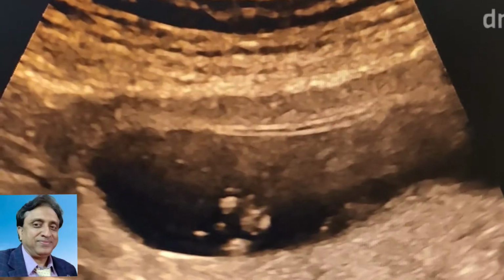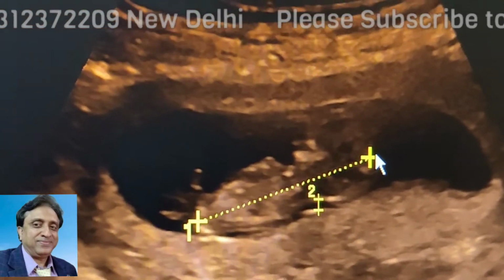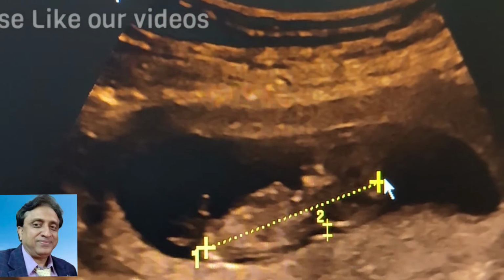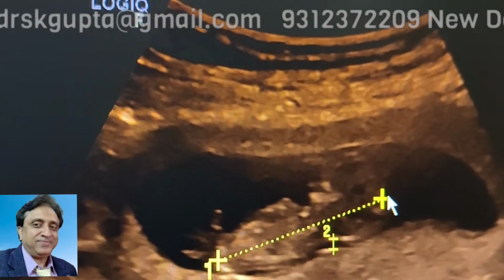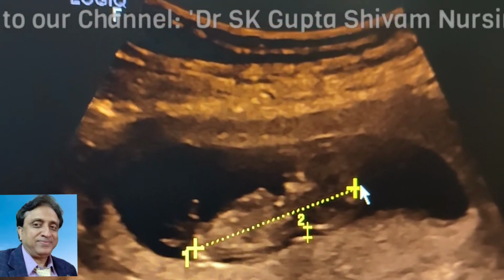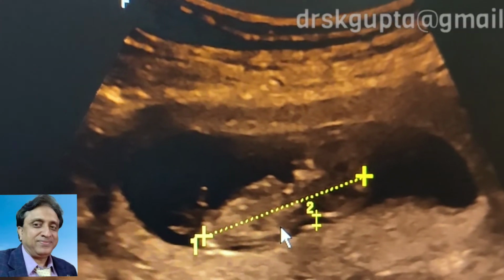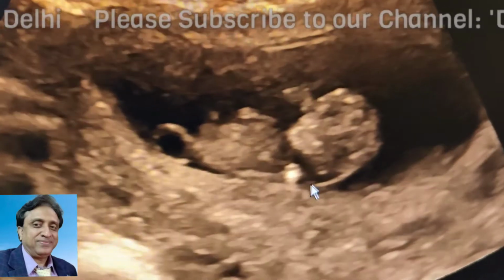This is the fetus, and you can see this is the rump and this is the crown, and the total length from the rump to the crown is called the crown rump length, or the CRL. This is the way we measure the CRL, and the CRL is a fairly good diagnostic of the accurate gestational age. Rather, it is better than multiple parameters including the BPD, AC and the FL, and it is valid up to 13 weeks of gestation before the spine starts developing and takes a curvature. Here the curvature of the spine has not developed, so the crown rump length is a fairly good measurement for the ultrasound guided gestational age.